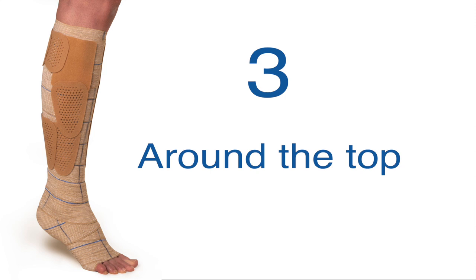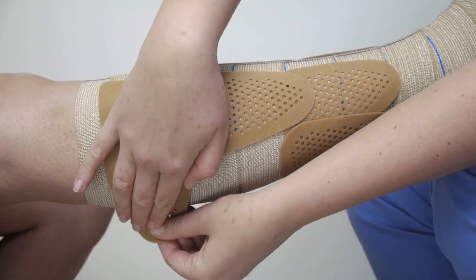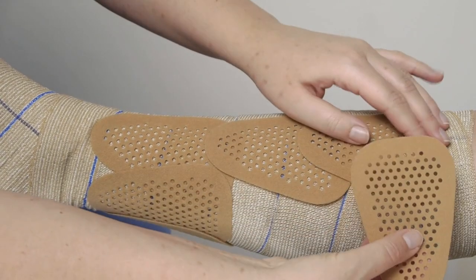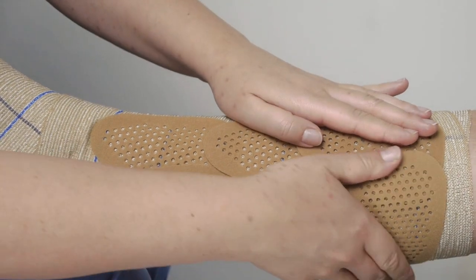The next step is to place the patches horizontally along the bandage's upper edge. Place the upper patches about 2cm below the bandage edge, and continue to place press patches below the upper bandage edge.